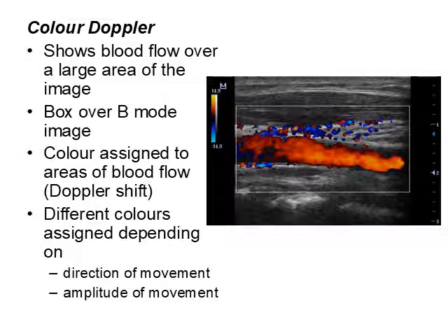And what you'll see on the side here is a colour scale. Now these colour scales can be changed. We're very used to using red and blue, and we're very used to, in medical terms, thinking red is oxygenated blood and blue is deoxygenated blood. So your red's your artery, your blue's your vein.